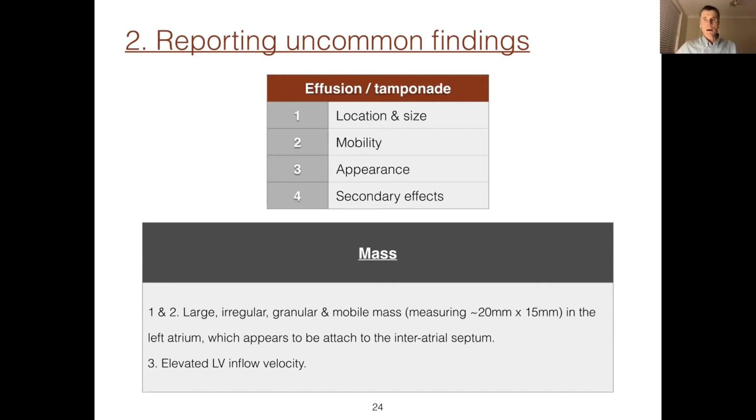So with that in mind, if masses occur within a chamber, normally you want to work out whether it's impeding blood flow. If you see a mass or a vegetation on a valve, typically what you'll want to be measuring there is regurgitation. A vegetation on a valve typically impacts the leaflets, coaptation, so there's regurgitation. A mass within a chamber affects flow typically by restricting the flow.